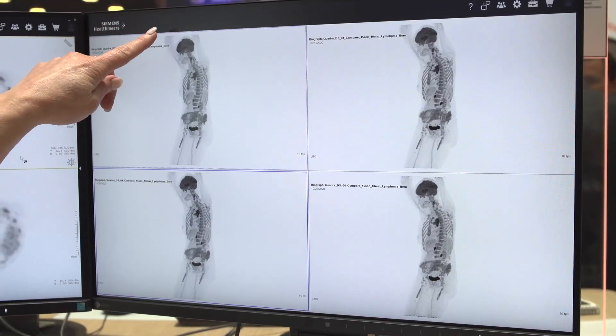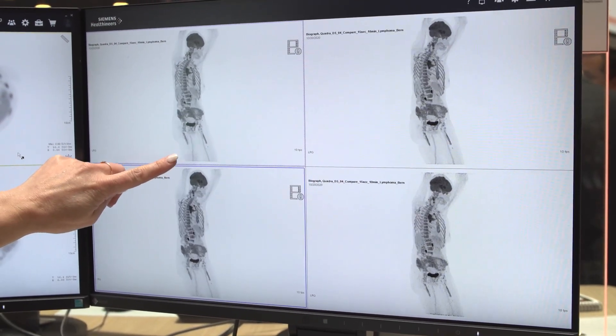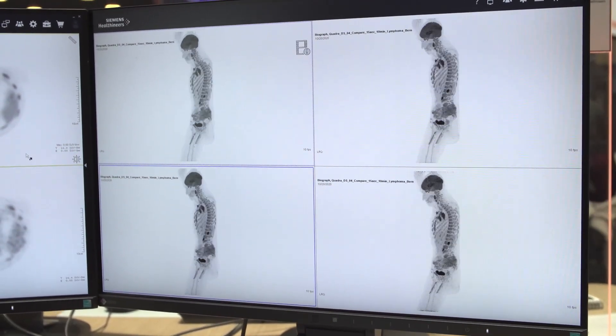What I want to review today is a patient that was acquired from our customer site out of Bern, Switzerland. What is truly remarkable is you can get an image from the top of the head down to mid-thigh in one field of view, which is 106 cm — we've never been able to do this before.